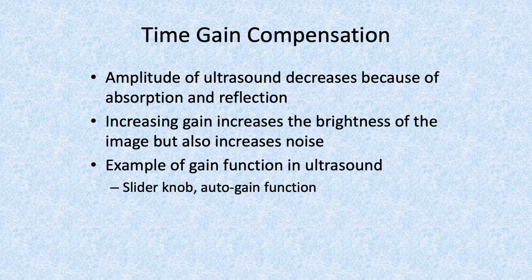By increasing the gain, sometimes you can see the structure better, but there will be more noise. The other areas surrounding the structure will also become brighter. That's the downside of gain. But you can improve your image a bit. The surrounding structures also become brighter sometimes, and then it might affect your view of the image.